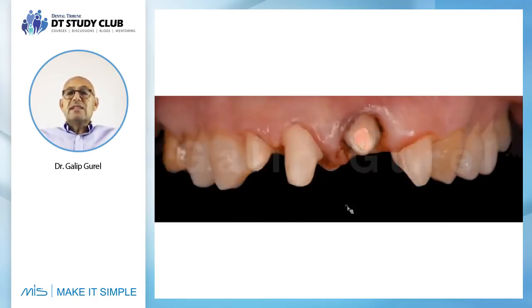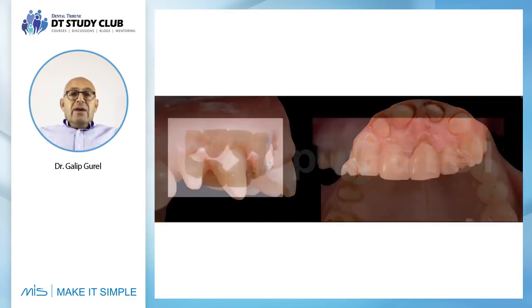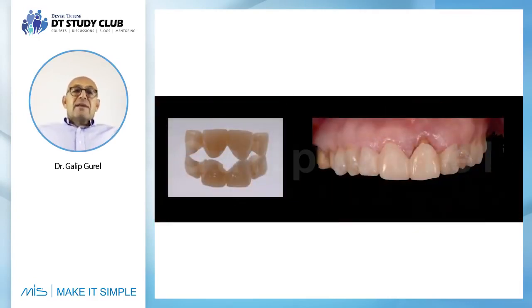And this is the final situation. So on top of this, as you can see here, this is what I'm trying to mention. I have gone all the way in, prepping it in this direction. Before it was coming out like this. We prepare a 4-unit provisional bridge, and we are placing this, and you see how the root surface is standing outside of this surface, and simple enough.